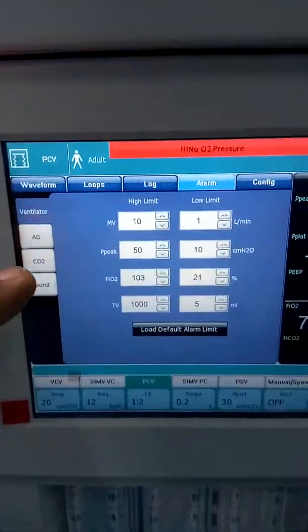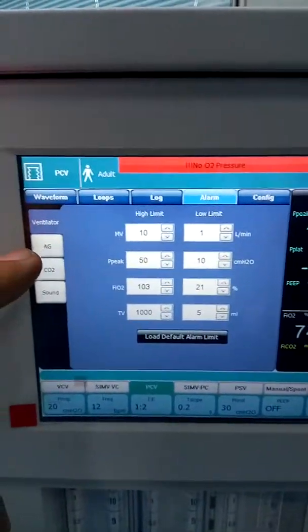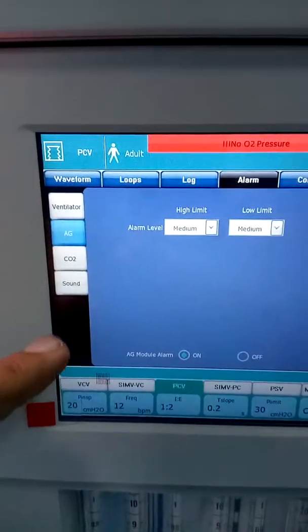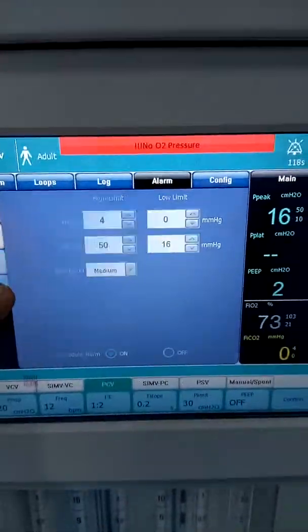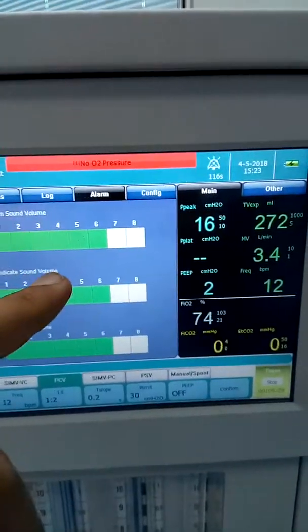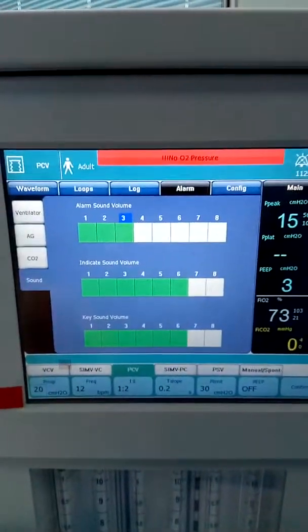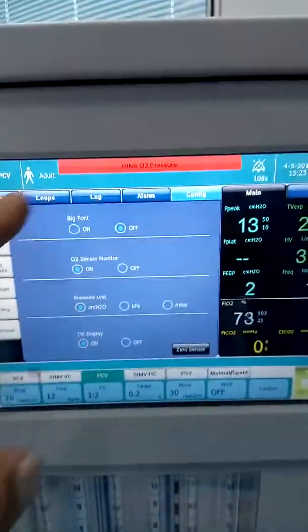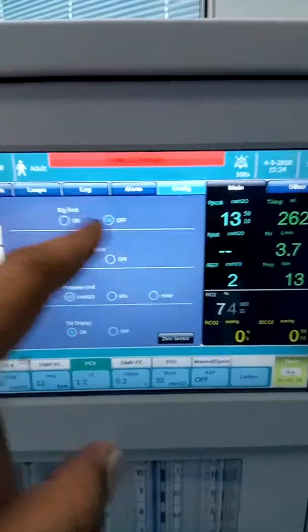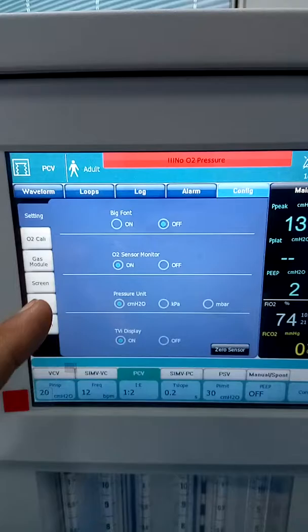In the alarm section you can set the low and high alarm limits for the ventilator. This section is for anesthesia gas alarms, this is for CO2 alarms. You can also adjust the alarm sound volume — decrease or increase it here. In the config section you can set big font on or off, auto sensor, and whether you want oxygen monitoring enabled or not.